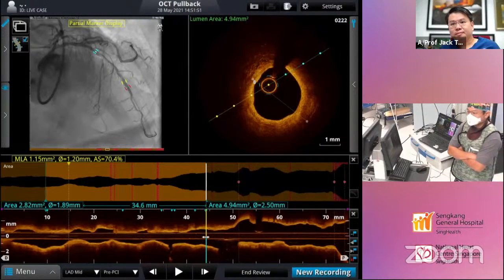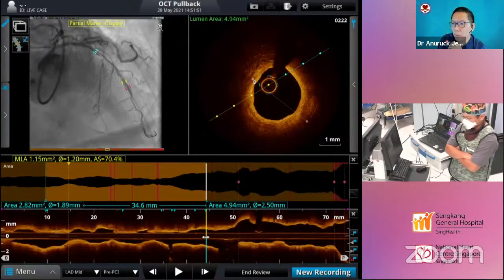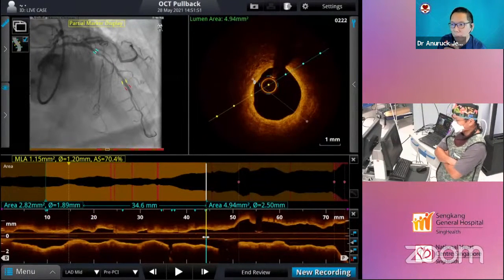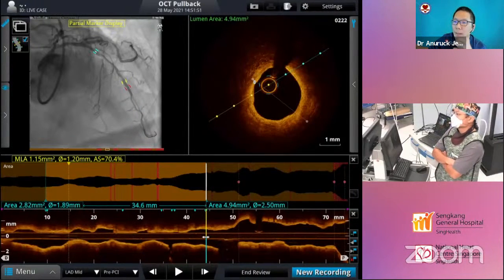Okay. For me, when you choose the lumen diameter for the stent, it will be very safe. And when you use the EEL for the stent size, you get good expansion and good luminal area. So both of them have limitations. For the small vessel, you have under expansion.